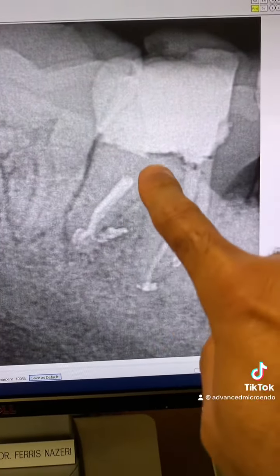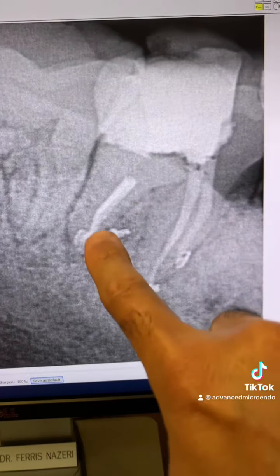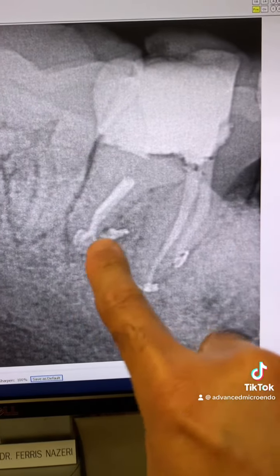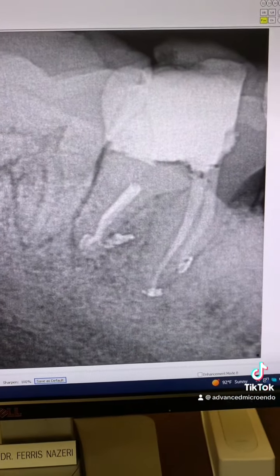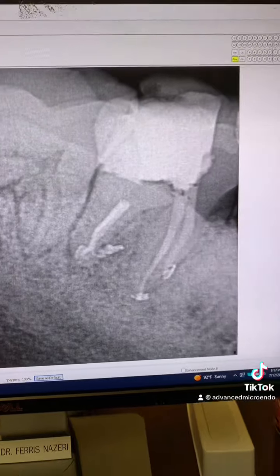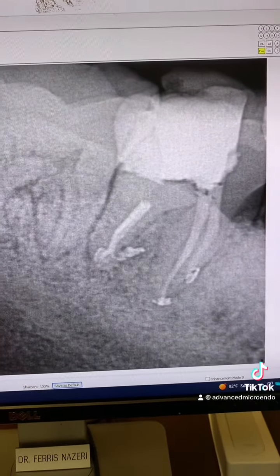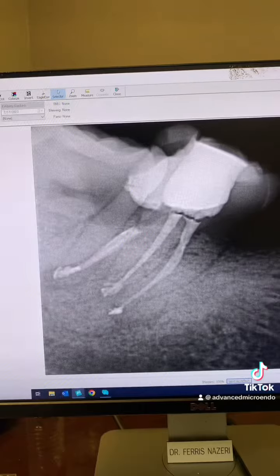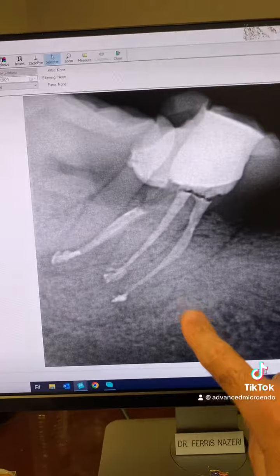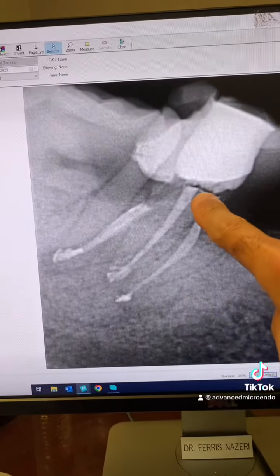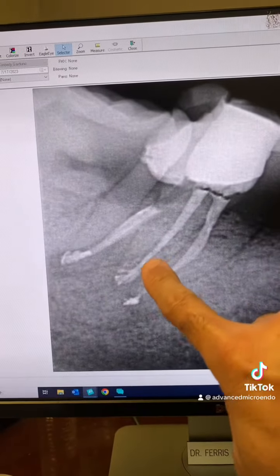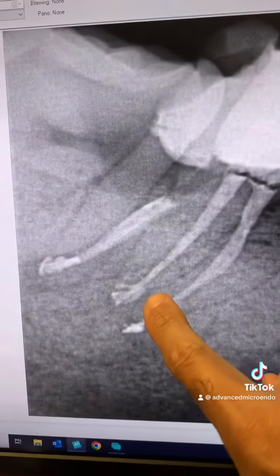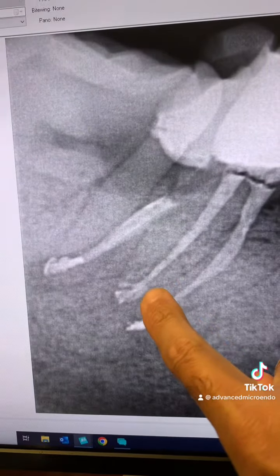Take a look here — look at this beautiful anatomy in the apical area of the distal canal. Let me show you a different angulation. Look at this angulation now. That's the mesiobuccal. Mesiobuccal is — look at that.